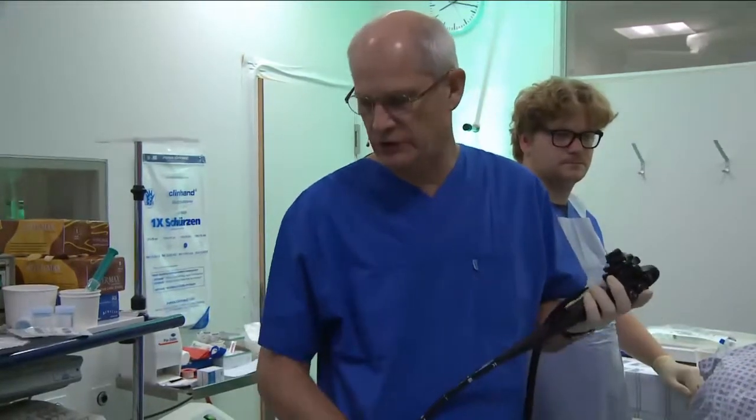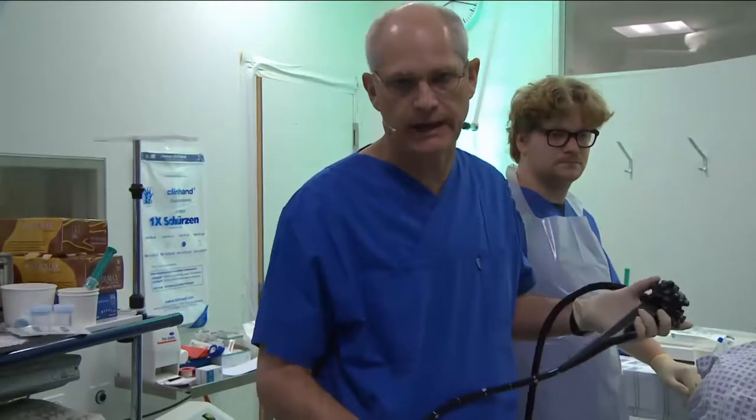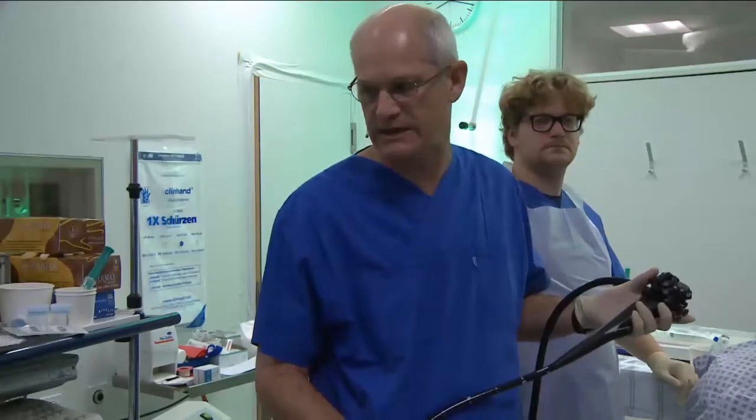Okay, well, welcome again. I think this is the first time to be able to show the linear echoendoscope. I have the therapeutic UCT 180 linear scope, and we're using it with the Aloka Alpha 10 ultrasound processing system.